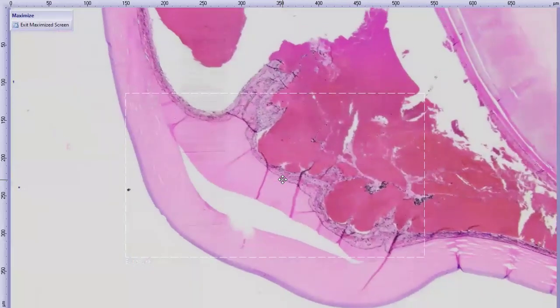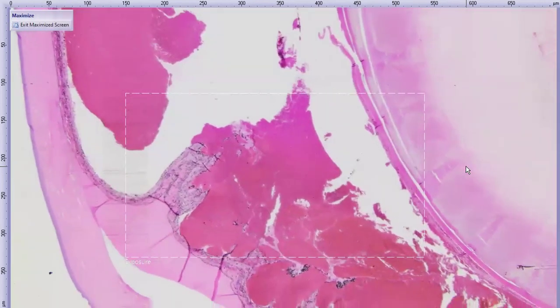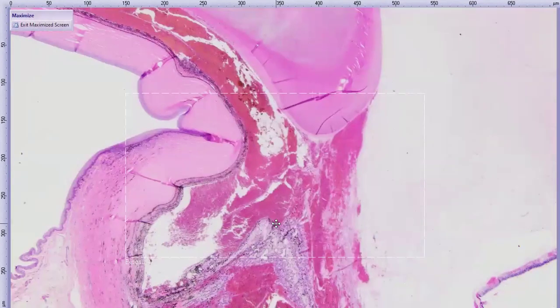So the anterior chamber is very narrow. The way the iris leaflet comes forward and then bows backward is very suggestive of iris bombé, where we have at least somewhat focal posterior synechia of the iris to the lens. And then in this case, we have hemorrhage building up behind it and also aqueous humor, which causes the iris to be pushed forward. So it sort of billows forward. So that's iris bombé.